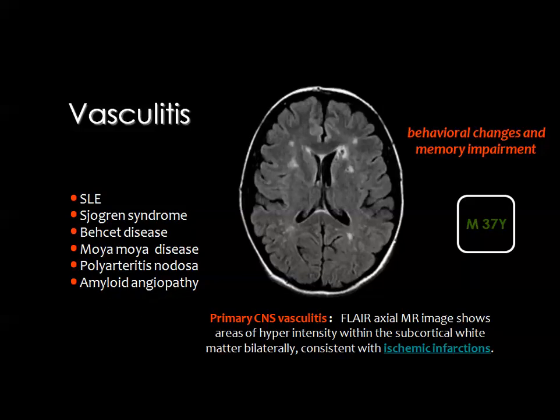In the previous days, we used to report the case as vasculitis whenever we see brain lesions that are multiple, and some of the lesions are hemorrhagic and other lesions are not hemorrhagic in a relatively younger patient. Then we think of vasculitis, and we search in the clinical picture of the patient to find any of these diseases which can explain the picture.